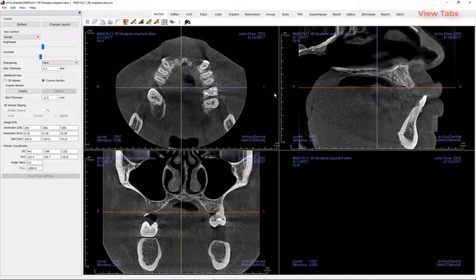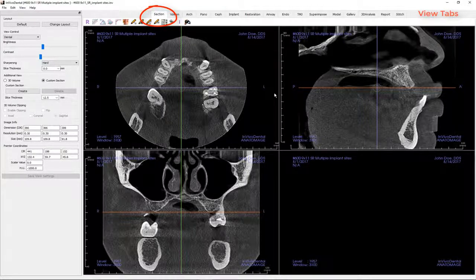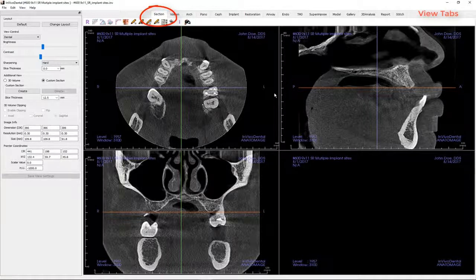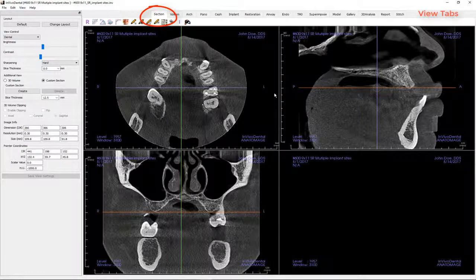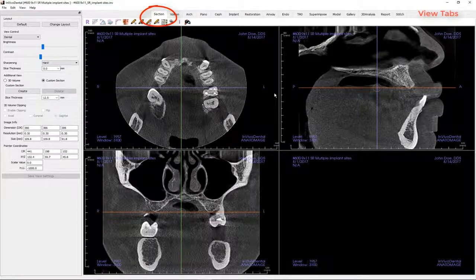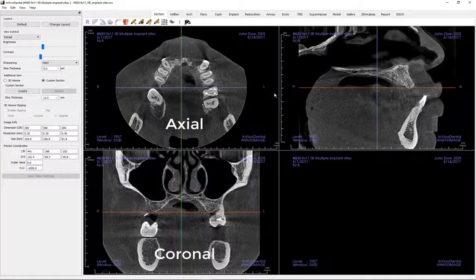View tabs allow you to perform specific tasks or look at specific areas of interest. For example, the Section View tab gives you the ability to view orthogonal planes, create custom sections for 2D visualization, and to make distance measurements within the cone beam computed tomographic volume, or CBCT volume, or within the airway.